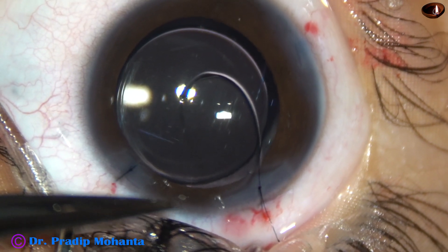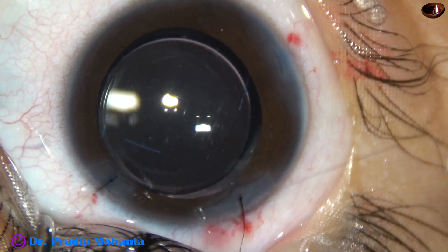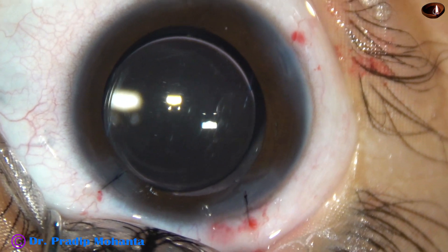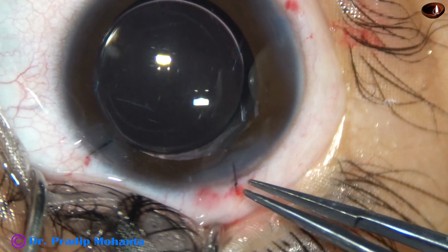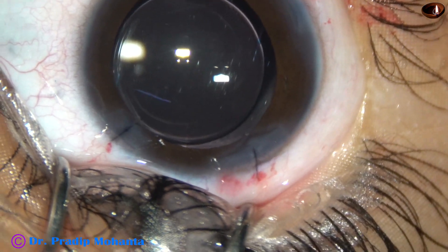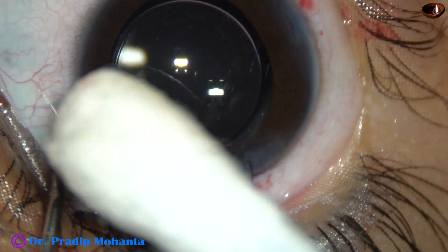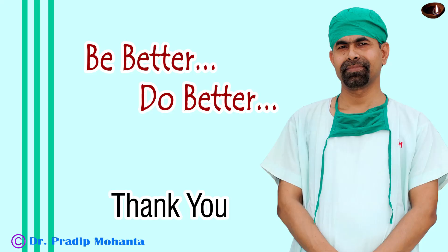In this video we have seen a lot of things. While doing the rhexis — anterior CCC or posterior CCC — we must keep a balance between the centripetal force and centrifugal force to get the right kind of rhexis. We must do anterior CCC, posterior CCC, and suture the wounds, then conclude the case. Thank you very much for your attention. Hope this video will help you in developing your surgical skills. Please learn posterior CCC — it is not difficult. You just have to find a balance between centripetal force and centrifugal force. Be a great surgeon and serve the patients with love, respect, empathy, and great surgical competence.